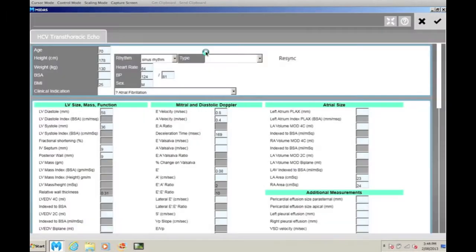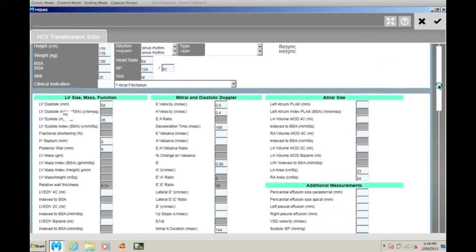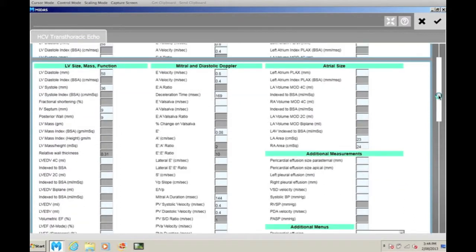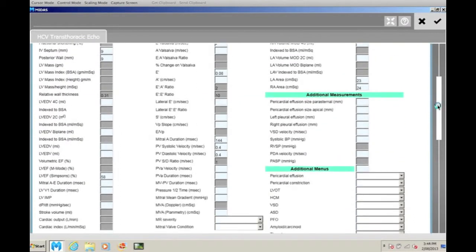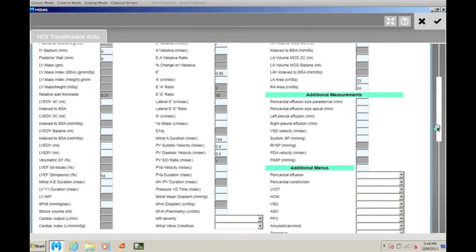The measurements and observations can be manually input into the electronic ultrasound worksheet or automatically transferred from the ultrasound machine using DICOM structured reporting.